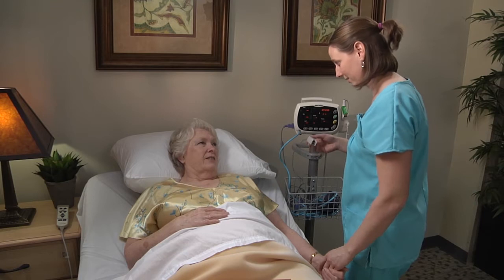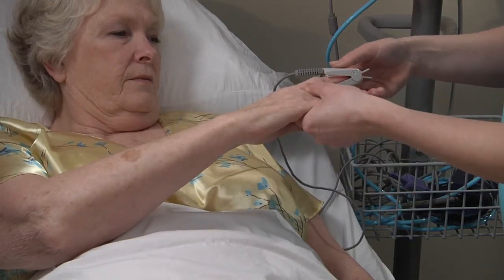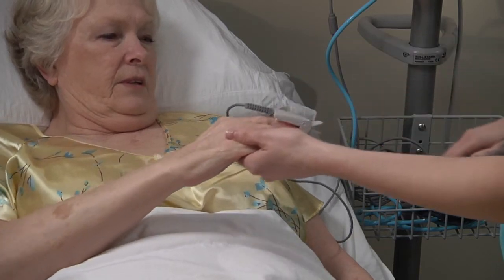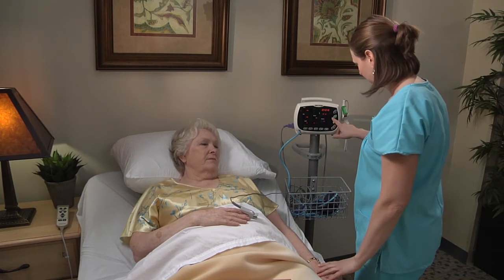To take pulse oximetry and pulse rate measurements, first carefully apply the finger sensor to the resident. As much as possible, try and limit the resident's movement to help maintain reading accuracy.